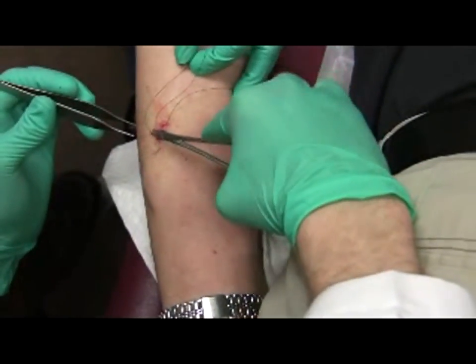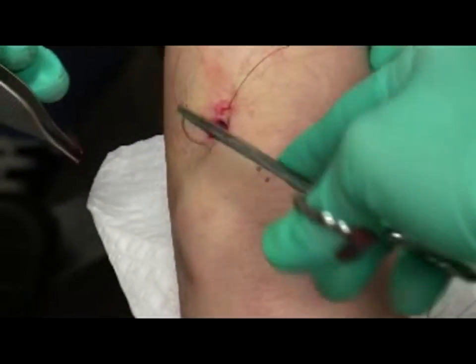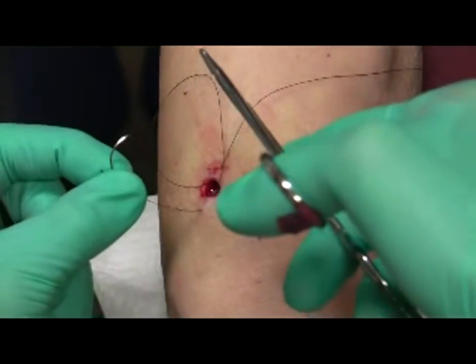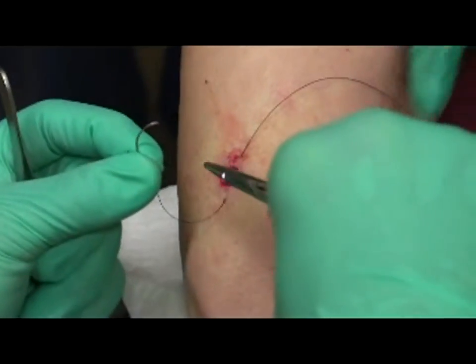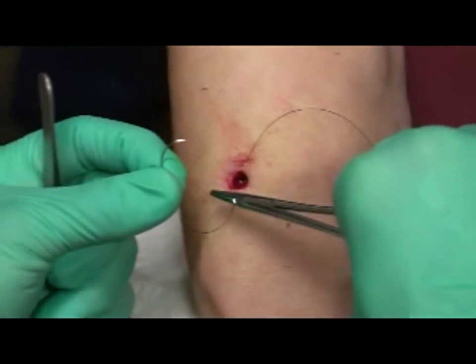Release the needle. Grab the needle point with the needle driver and pull the needle entirely through the second wound edge. Grasp the blunt end of the needle with your left thumb and index such that the needle points away from your fingers, in the same direction as your fingertips. Now this tail is very short — and the shorter it is, the better. I now want to make a circle with the suture where the wound is in the center, and I insert the needle driver in the center of that circle.